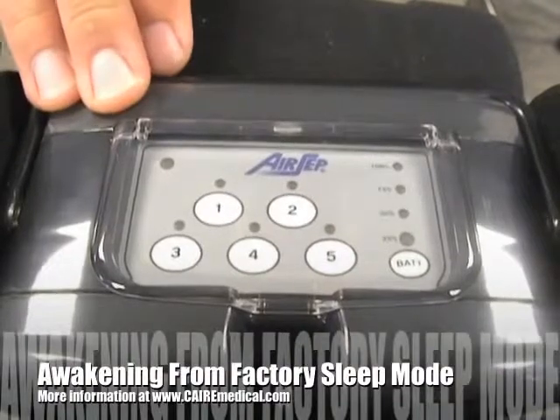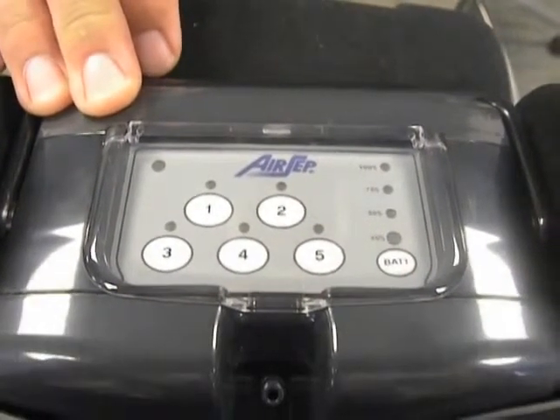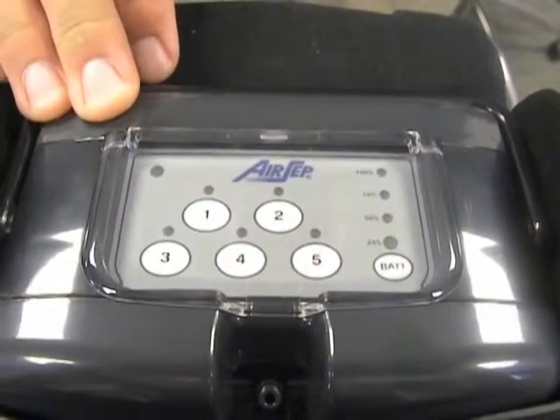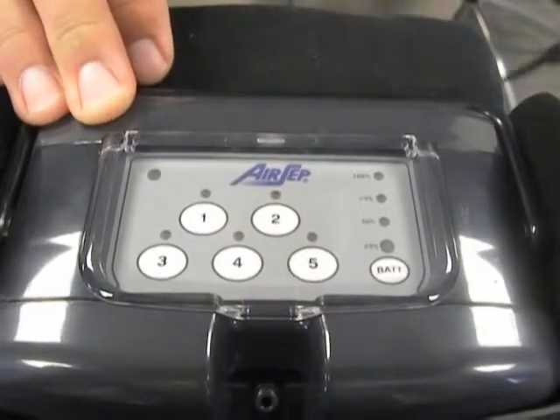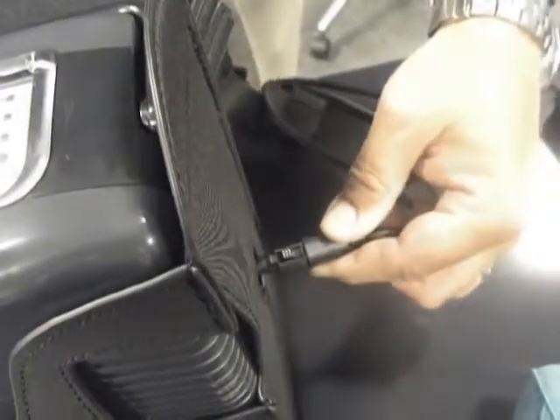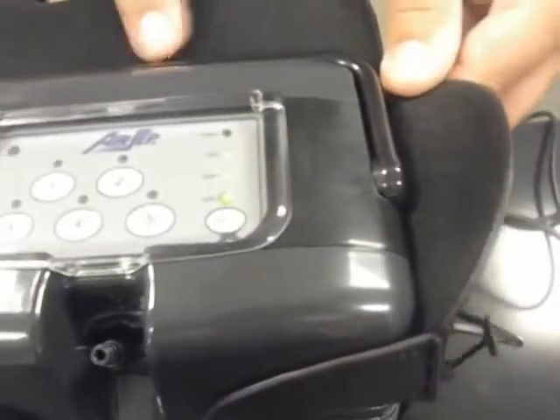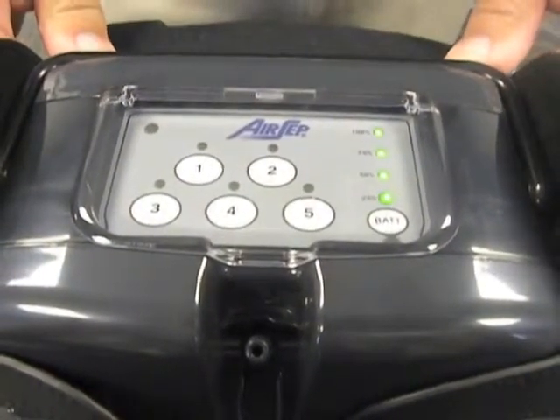When the FreeStyle 5 is received, it is shipped to you in sleep mode. Sleep mode is essentially putting the battery to sleep, waiting for patient use. To remove the battery out of sleep mode, you simply attach the AC power cord directly to the side of the FreeStyle, and in doing so, the battery is taken out of sleep mode and you can see the response of the battery. The FreeStyle 5 is now ready for patient use.